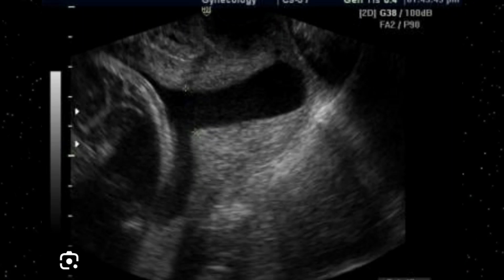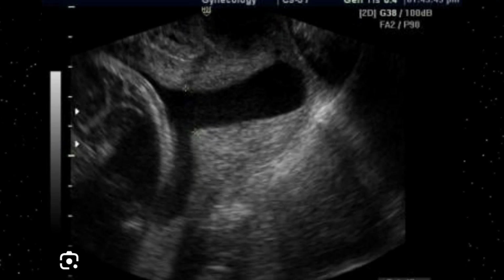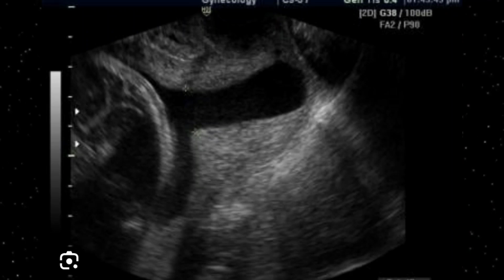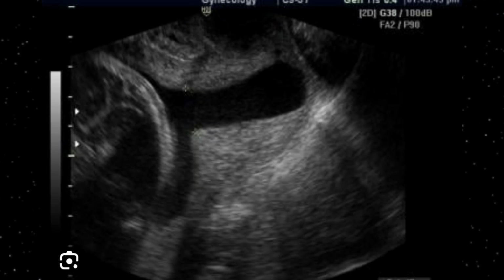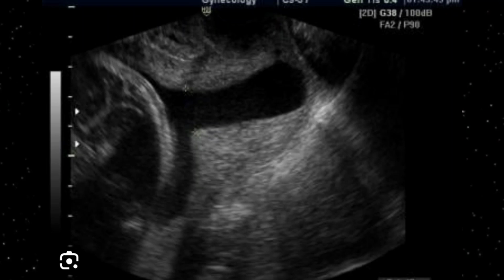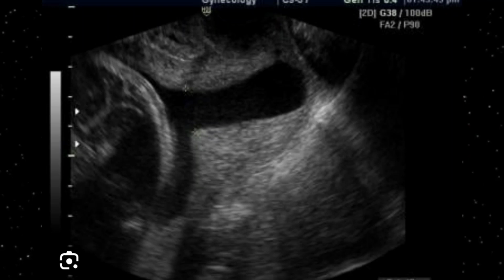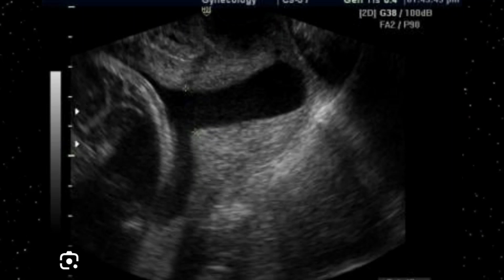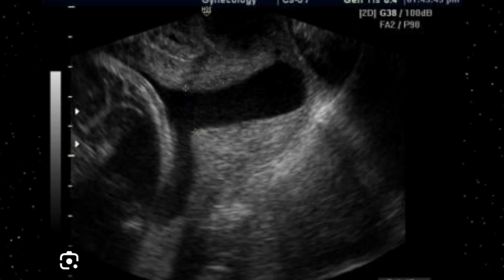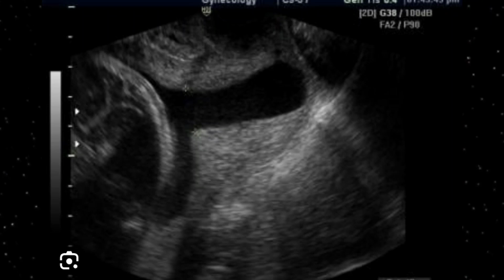If you are ignoring that during the scan, this would not be good practice. So appreciate the fetal head, and just beneath the fetal head, the internal os is markedly dilated. The endocervical canal is markedly dilated with filling of the amniotic fluid. So as for the width of the cervix, it would definitely be increased in size, more than 2 centimeter. And the cervical length also seems to be decreased from the normal.